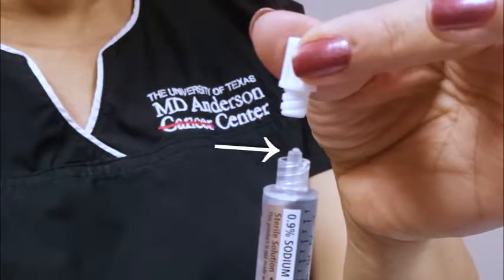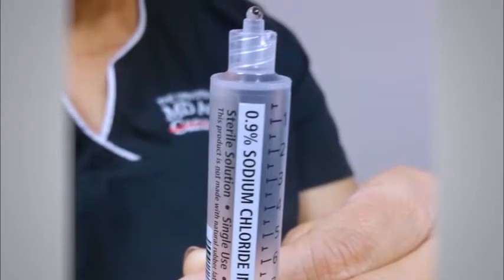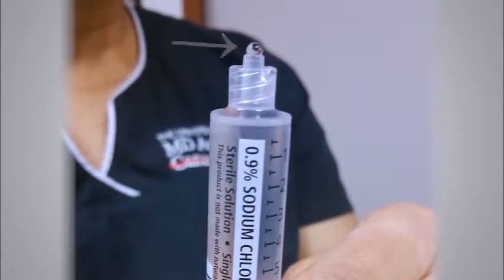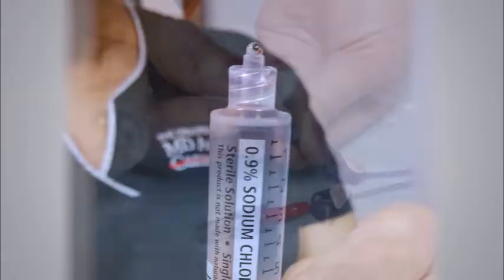Make sure to protect the sterile tip of the syringe. Do not lay the syringe down or touch the end of it. Push up on the plunger to clear the air out of the syringe. Continue to do so until you see fluid drip out of the end of the syringe. Continue to hold the syringe. The end cannot touch anything.